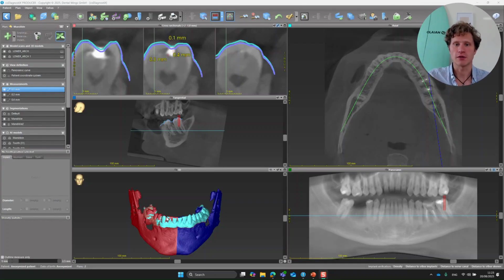Actually, in normal implant placement, when you place the implant, you will have a deviation of 0.3 millimeters, 1 millimeter, sometimes 2 millimeters. And the literature tells us that this is normal. The clinician's experience tells us that this is normal. And you will also have deviation here, and it increases this. And what is the purpose? To make your case worse. Actually, I don't understand it.